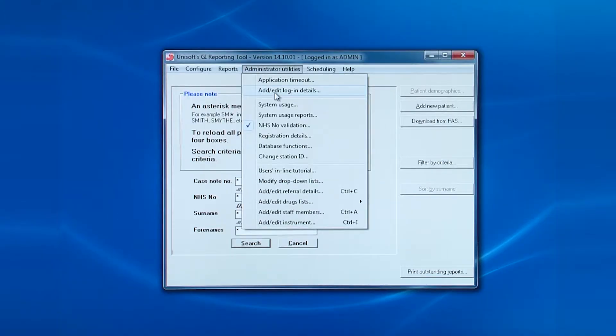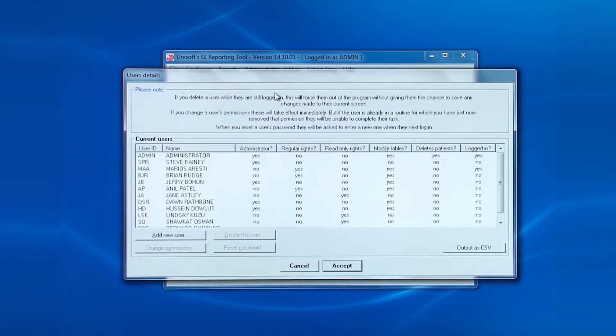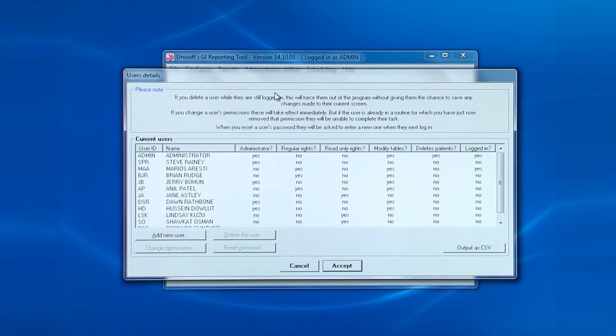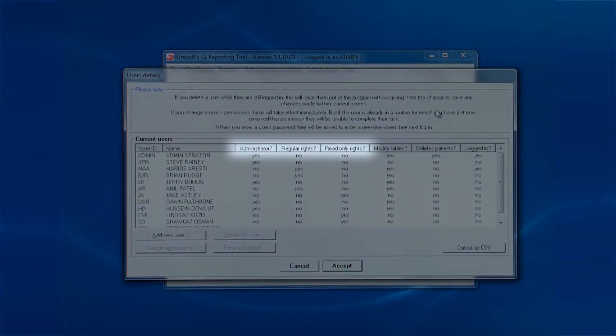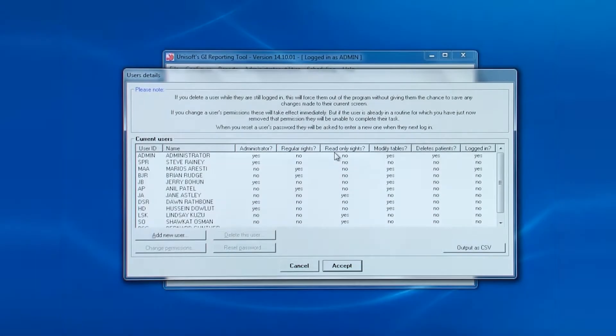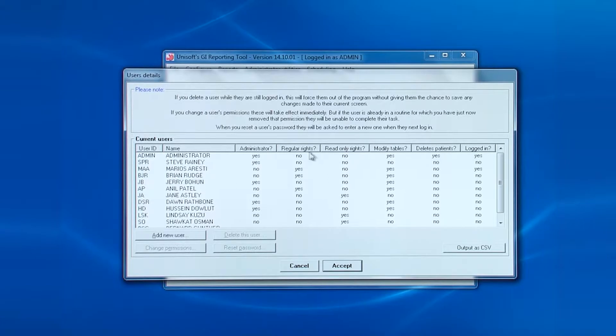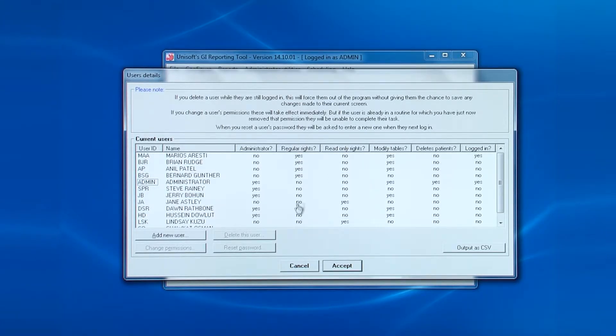So back to the screen. This is the entry for adding logins. Each login will belong to one of the three categories: administrators, regulars or read-onlys. Clicking on the headings sorts the list in alphabetical order.